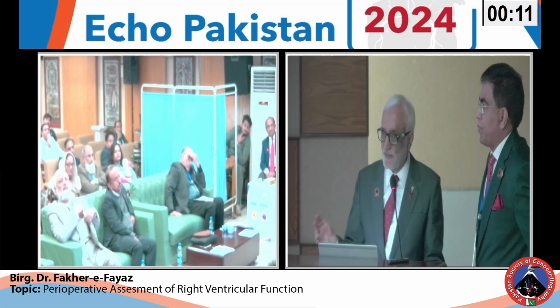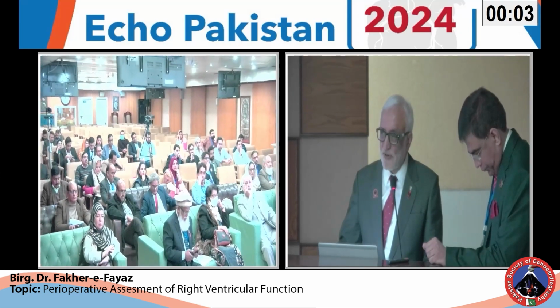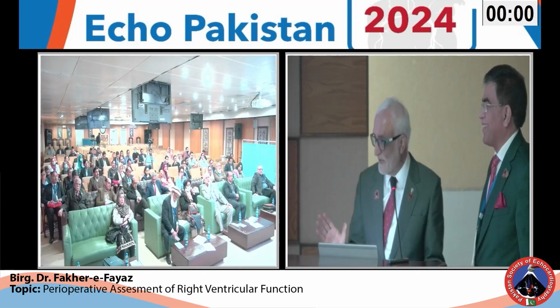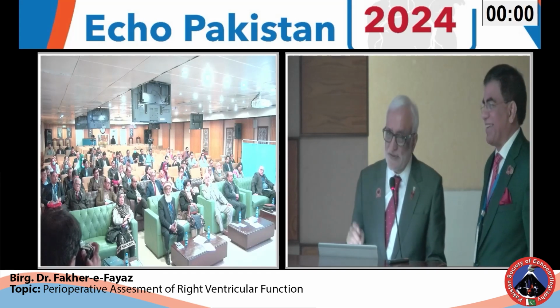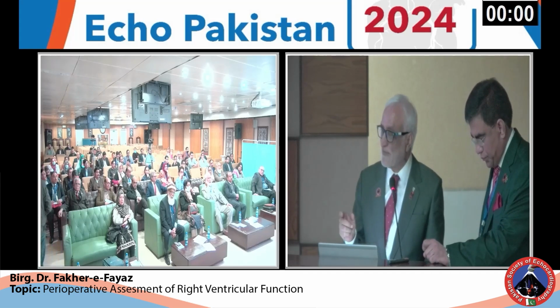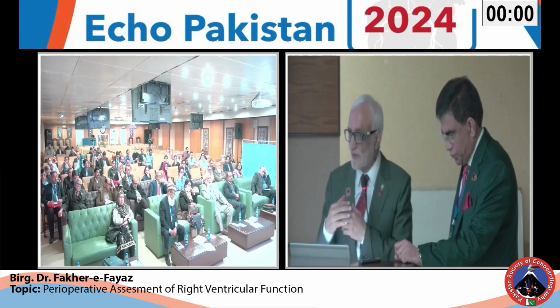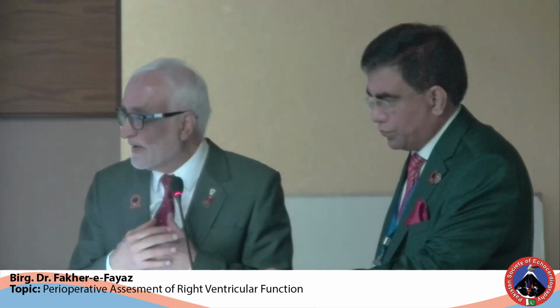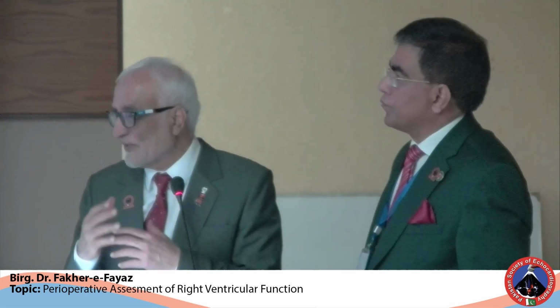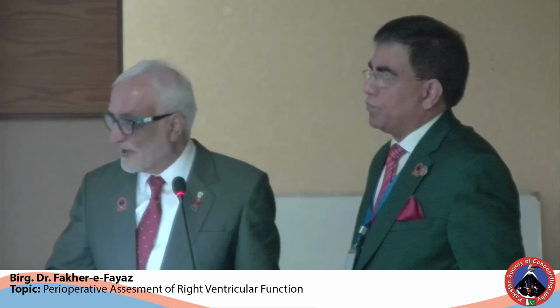The other thing is that after hearing Brigadier Fakher, we can say we have always been thinking now that the right ventricle is no more the forgotten right ventricle. That is very important. Why does the right ventricular strain become different, or you cannot interpret it after pericardiectomy? Because now the heart is actually moving as a pendulum and not contracting the way it was contracting when it was enveloped in the pericardium. That difference makes the right ventricular strain different. And I'm sure that he must have seen it while the operations were being carried out also.